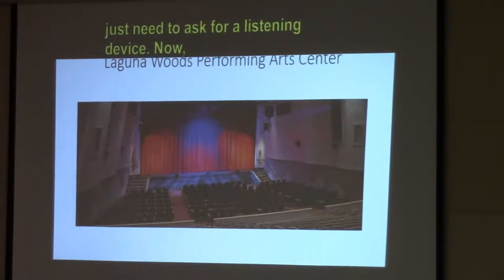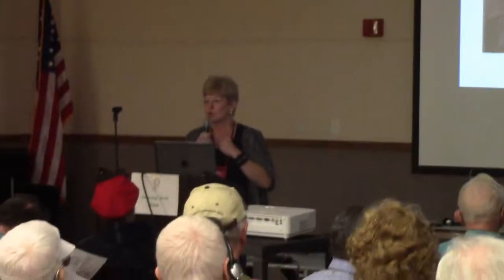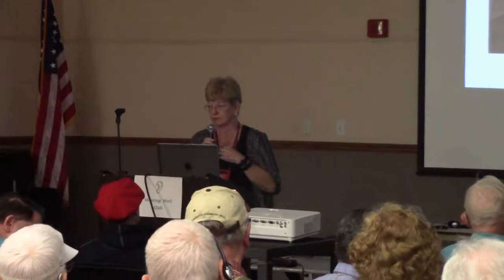Now, if you have a telecoil, you don't need to use a headphone. Big advantage. Instead, you will ask them to give you a neck loop. We're going to be talking about this in every venue that we're going to talk about today. So this is a neck loop. You put it on. You plug it into your hearing receiver, turn it on and adjust the volume, then turn on your T-coils and your hearing aids. And you don't have to wear a nasty headphone. Isn't that nice? That's another advantage to a telecoil.